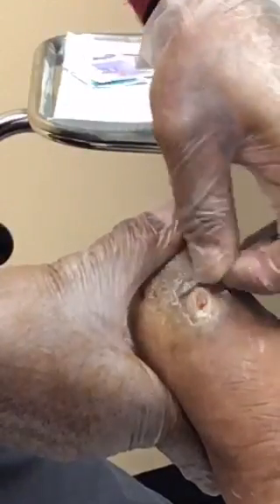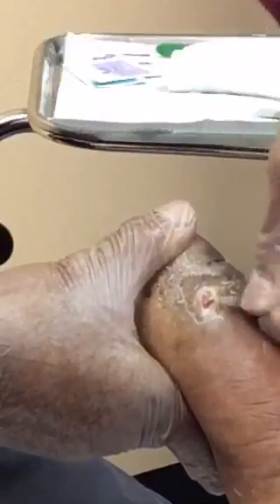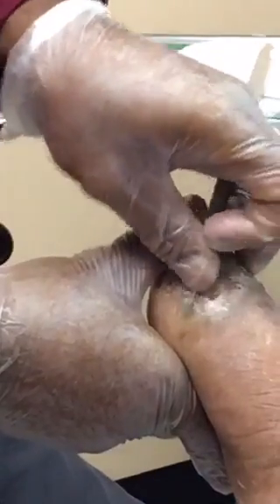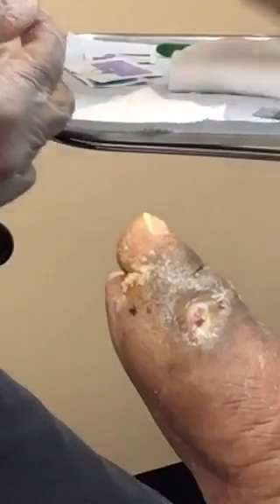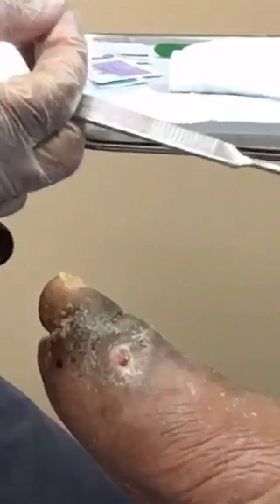Now that I've got the edge of the wound debrided to my liking, I will work on the center of the wound. I'm going to change blades here.